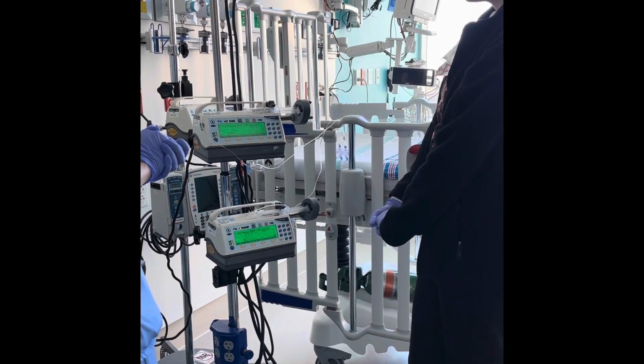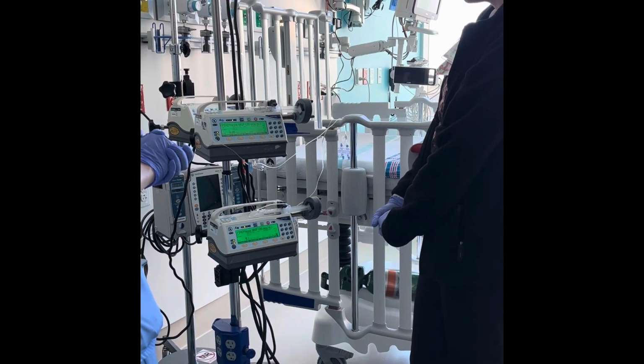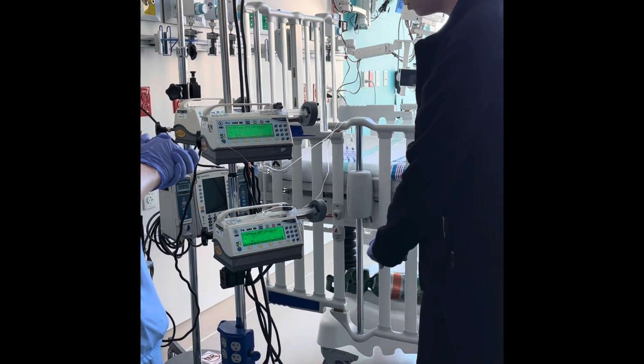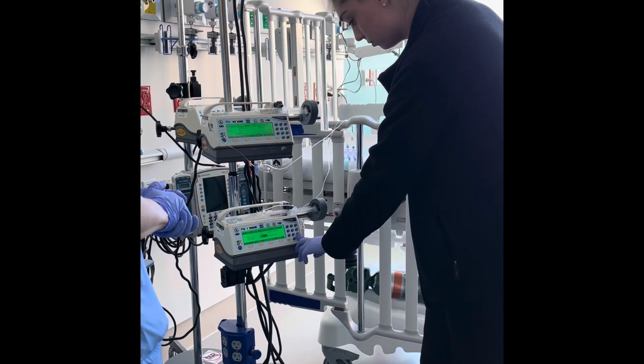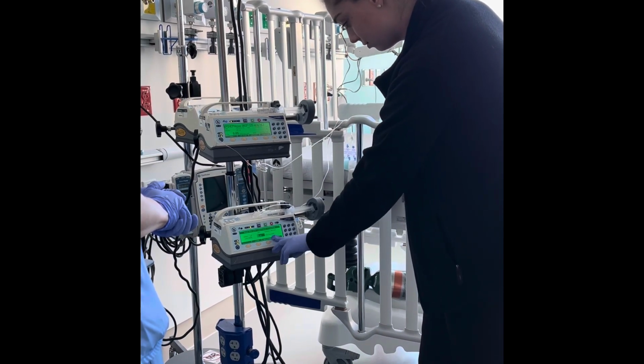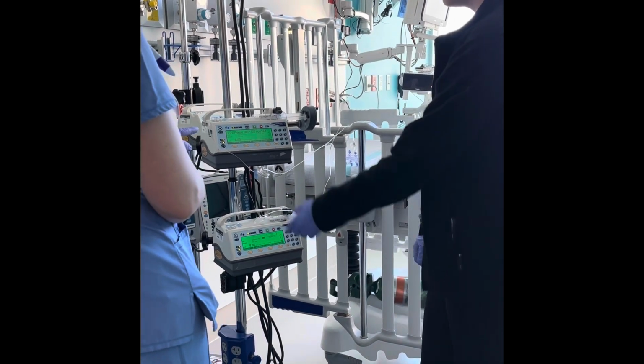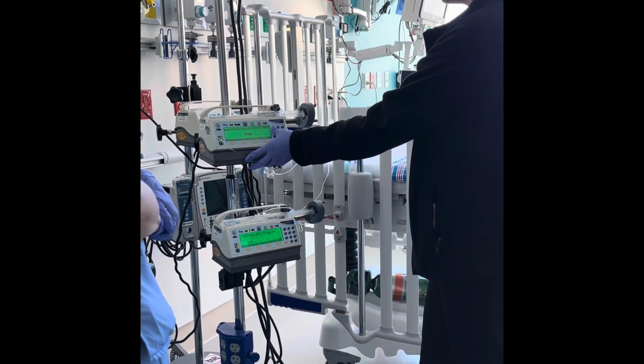Once you see an increase in your SBP by 5 millimeters of mercury, you may now decrease the old infusion to 50% of the current ordered rate, which will be 0.05, and you will increase the new infusion to the total current rate, which is 0.1.